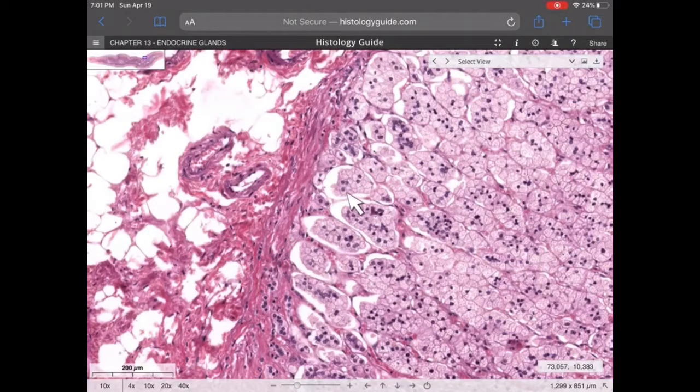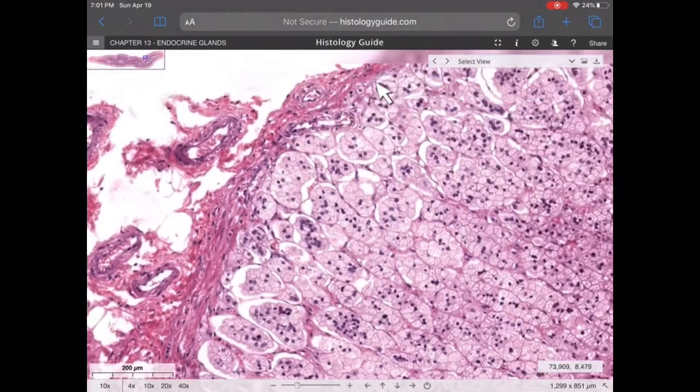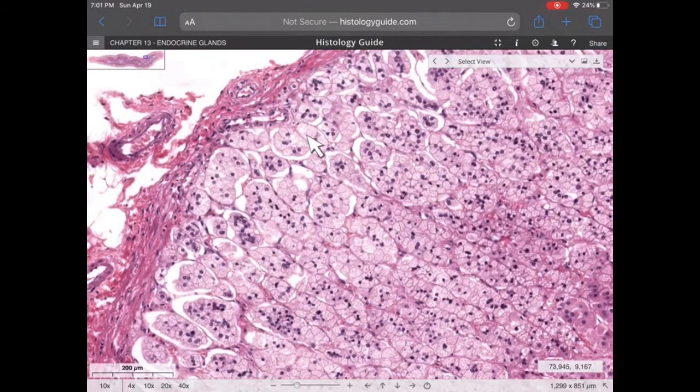So these are going to be a group of hormones that regulate water balance, for example. So aldosterone acts on the kidneys, and other ions, hence mineralocorticoids. So I'm moving the cursor a bunch here to point out the clumps of cells, also called glomeruli, in the zona glomerulosa. So roundish clumps of cells are a hallmark for zona glomerulosa, as is the fact that it's right next to the very edge of the gland and therefore right next to the connective tissue capsule.